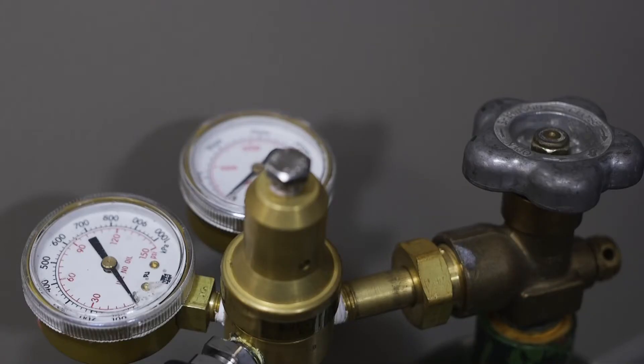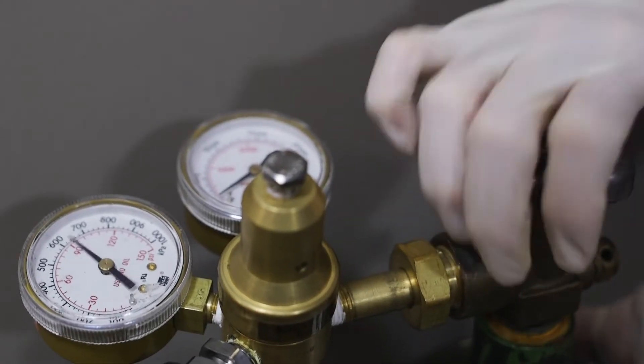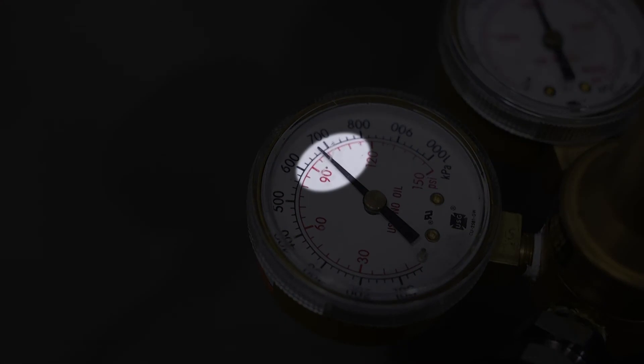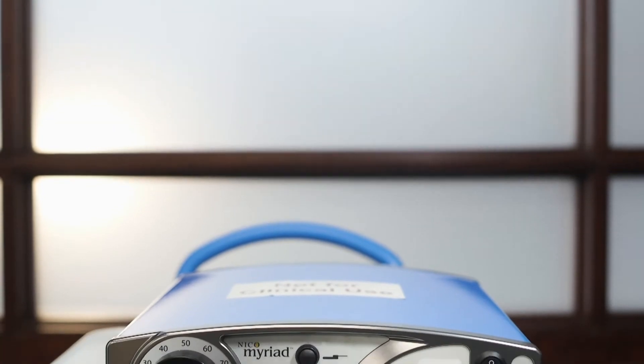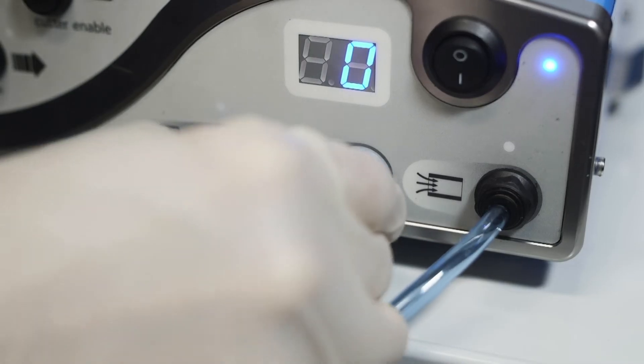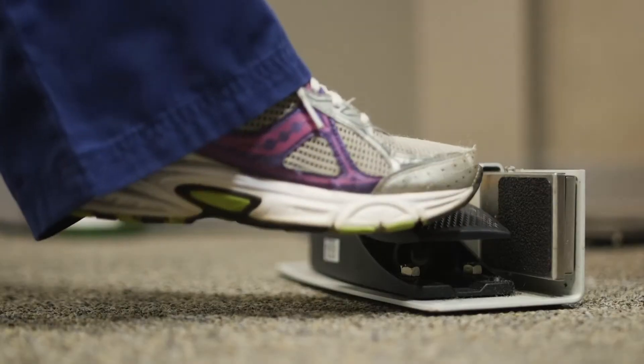Before attaching the line, confirm that the supply pressure does not exceed 100 psi, the recommended input supply. Once nitrogen has been supplied to the console, the console will generate its own aspiration when activated by the foot pedal.